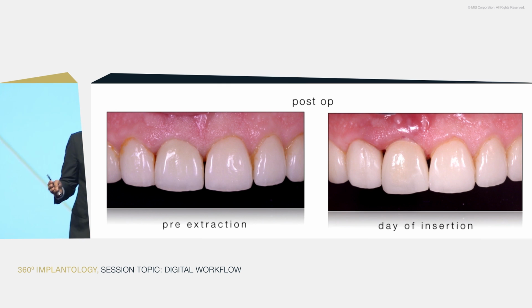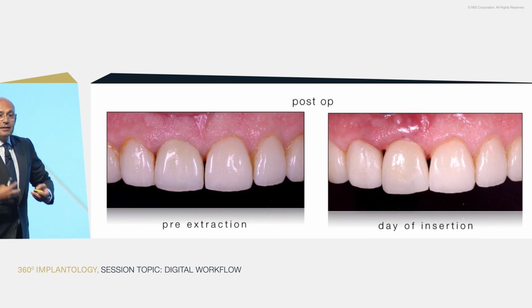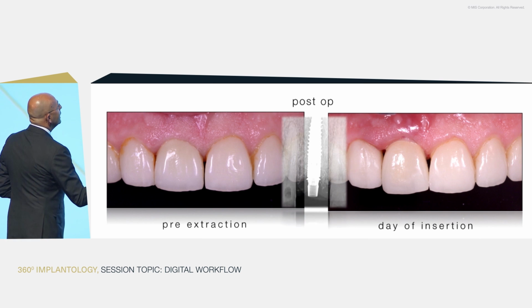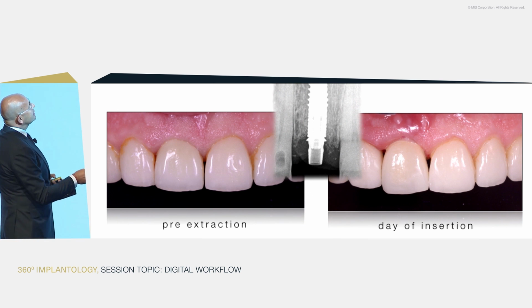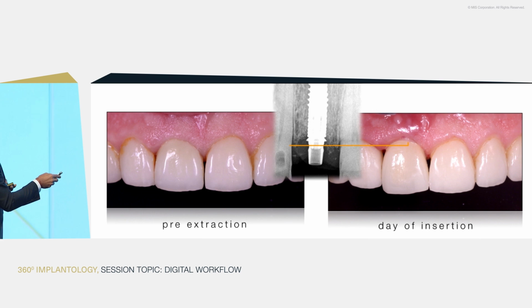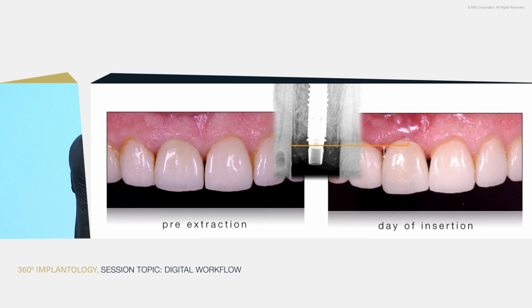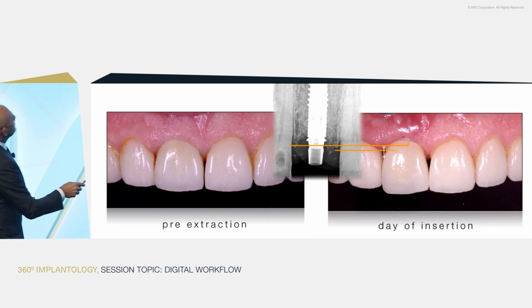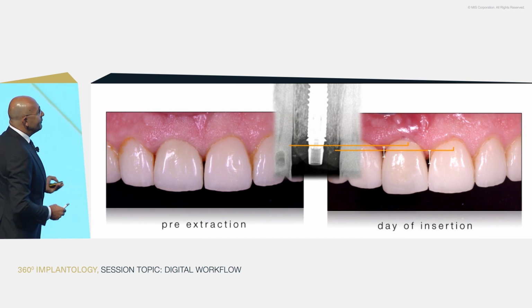So do I have to panic? No, I just need to wait, because there is mature tissue behind it. So let's see what happens here. This is my implant, and when I look at the bone levels, especially the crestal bone, I can see that this part will be so easily filled in the near future. So as this peak will fill up the space between the centrals.